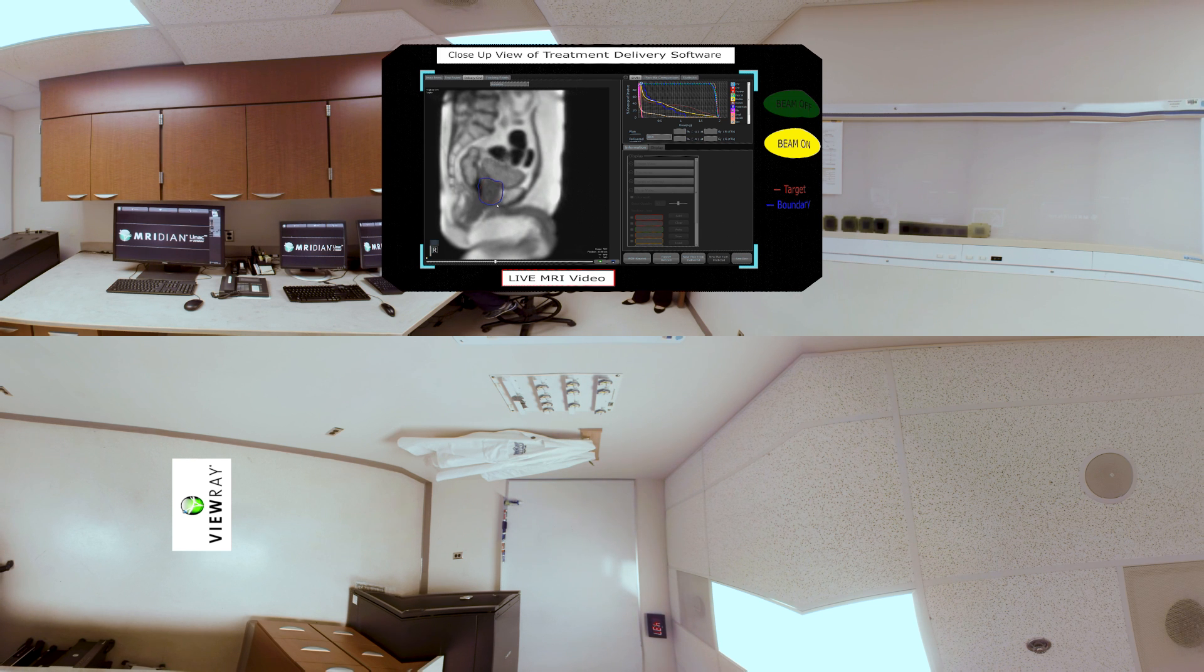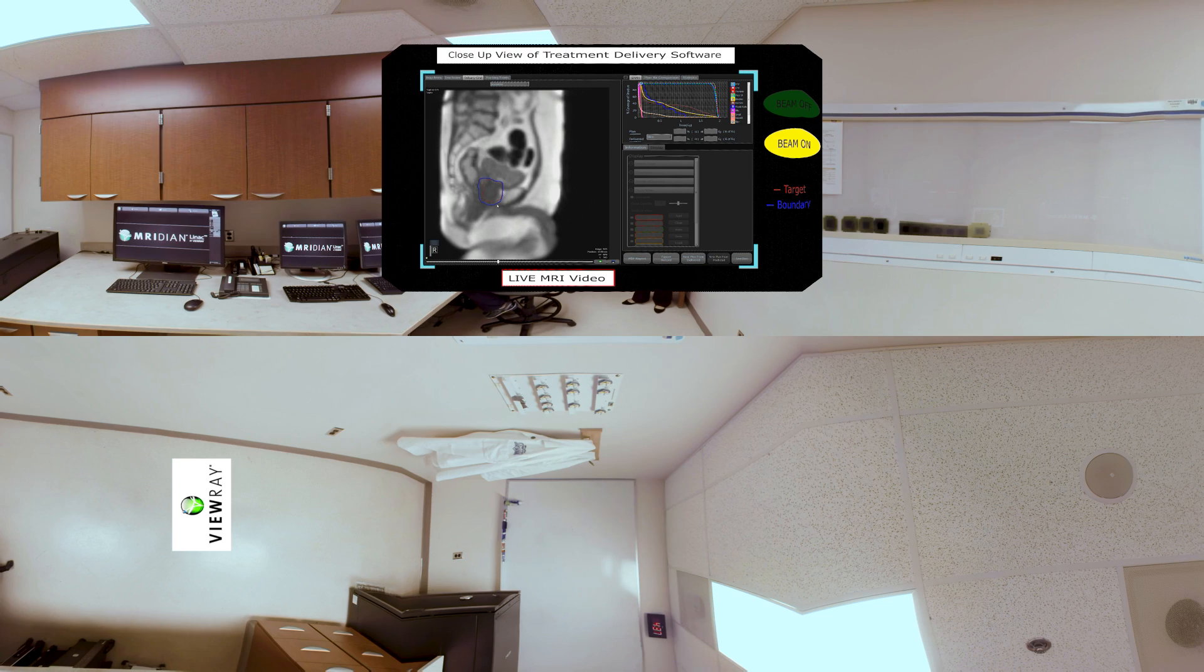And now the prostate is back into the area and the beam has turned back on. This is amazing. That's incredible.